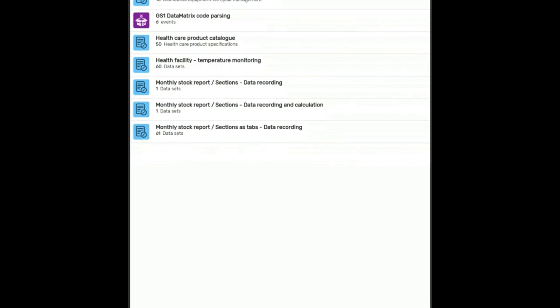Okay, so I'm going to briefly demonstrate our biomedical equipment life cycle management tracker program. You will open it from the home screen by tapping on the item.